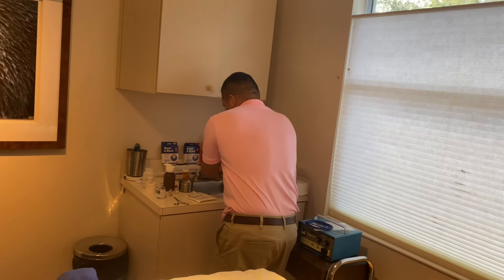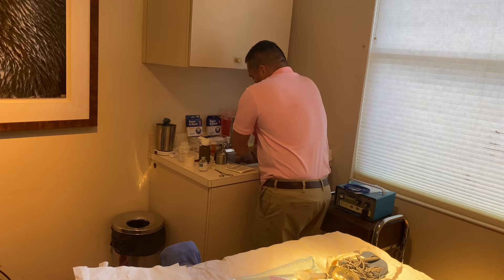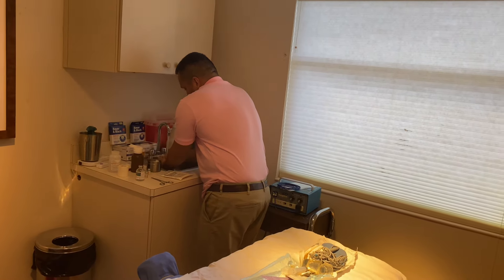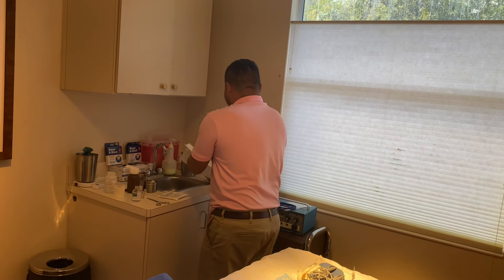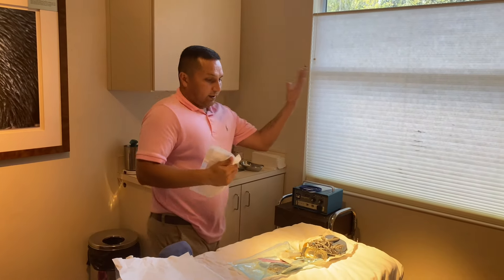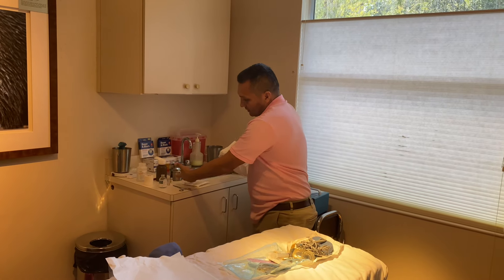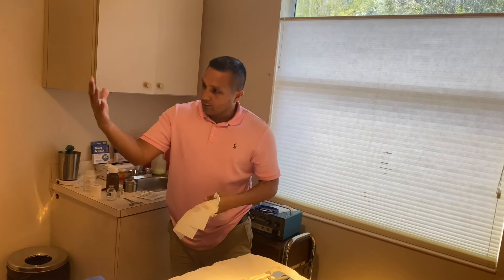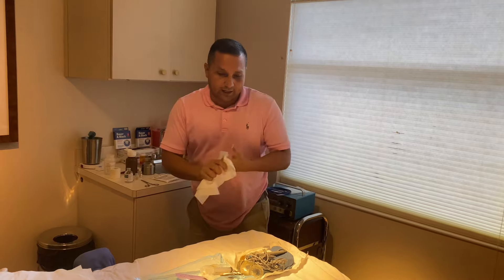Now comes the time where I'm going to set up for the reversal. I need to clean my hands — still have to be sterile. At one point in the video, you'll see that I'll contaminate my left hand. When I contaminate my left hand, it means I break sterility on that hand.